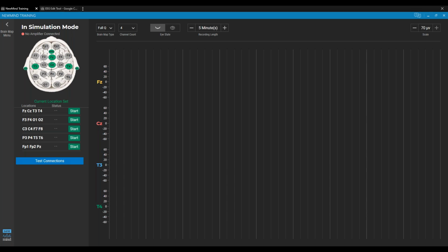Mm-hmm. So that's a whole other thing to deal with, with training protocols and whatnot. But yeah, that beta spindling is another one that our software just views as artifact, and it's trainable. Yeah. Well, I'm thinking leave it, don't artifact it, leave it in, and then see if there's a change. Mm-hmm. With the spindling, you may have to just count the episodes or the length of them manually, but it's just a thought.